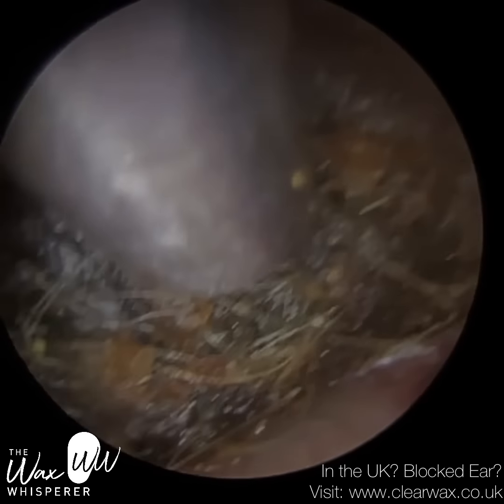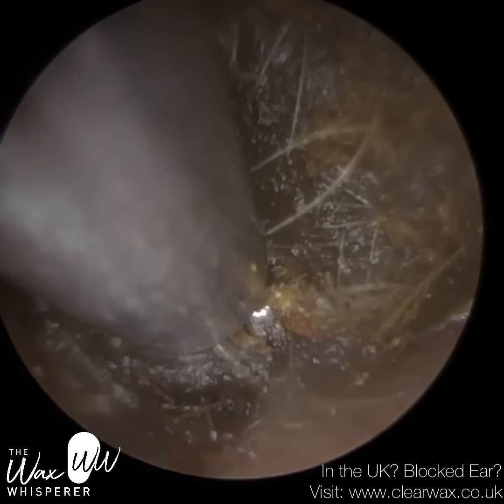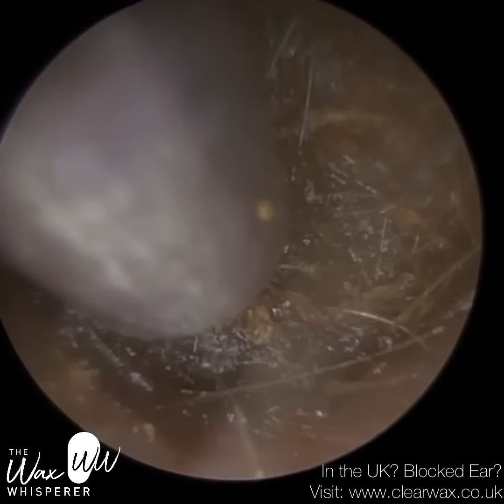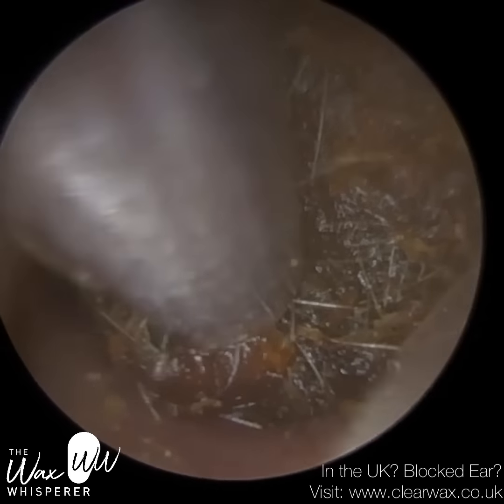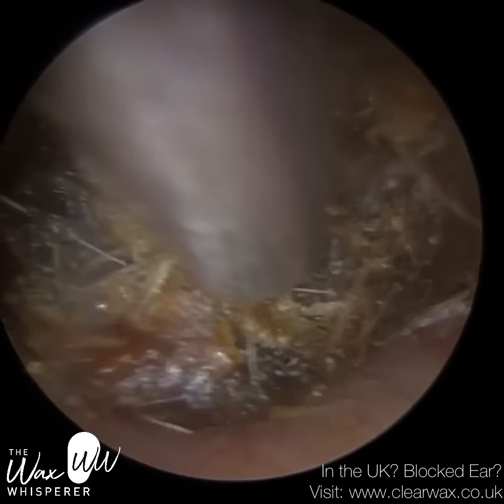There are a few hairs that are matted against the wax as well. Now, the patient walked in today. Normally it would be appointments only, but a lot of our clients call to book an appointment.